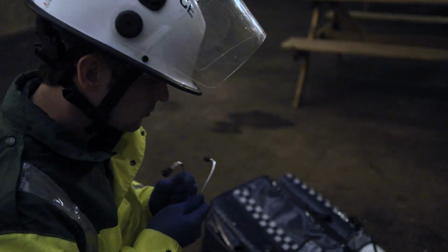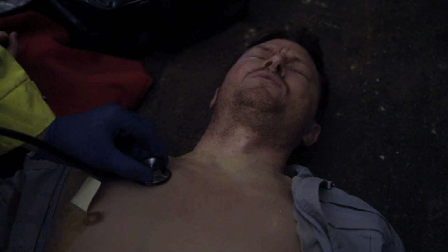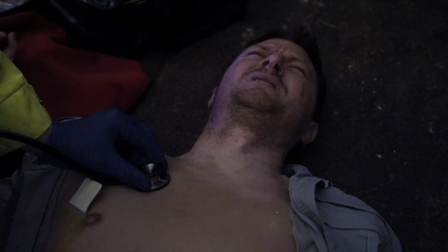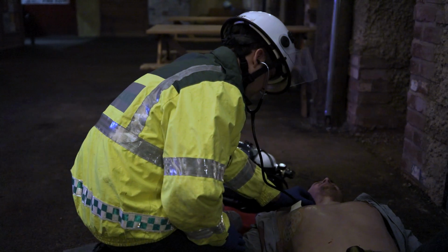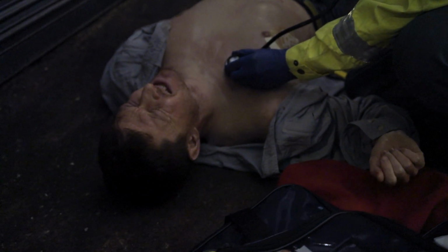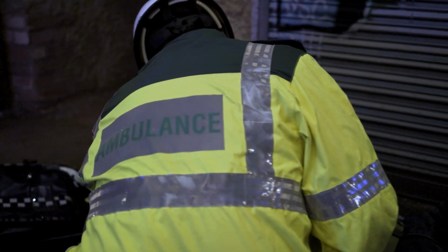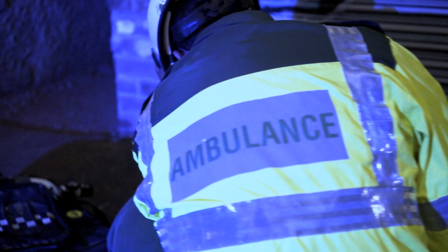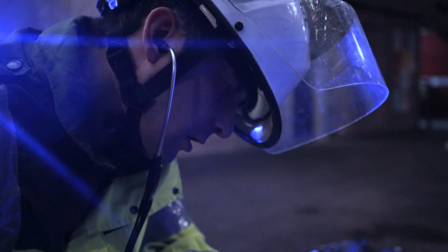It is important to continue to assess the casualty and monitor action of the chest seal. Monitor the casualty for the potential development of a subsequent tension pneumothorax. If the casualty develops increasing hypoxia, respiratory distress, or hypotension and a tension pneumothorax is suspected, treat by burping or removing the dressing, needle decompression, or finger thoracostomy.